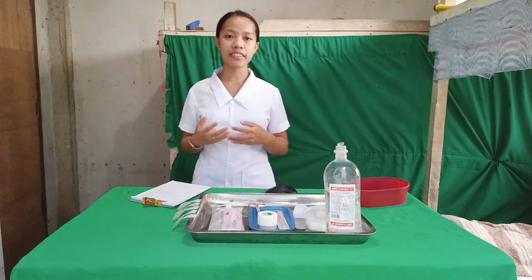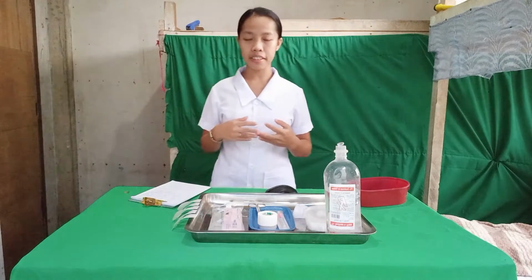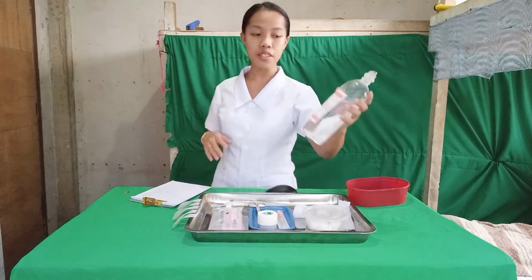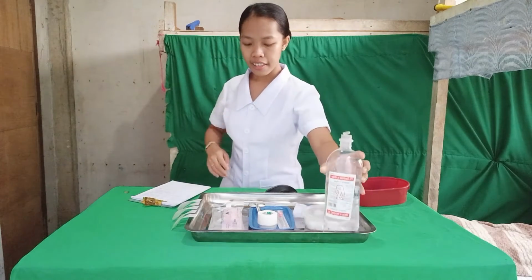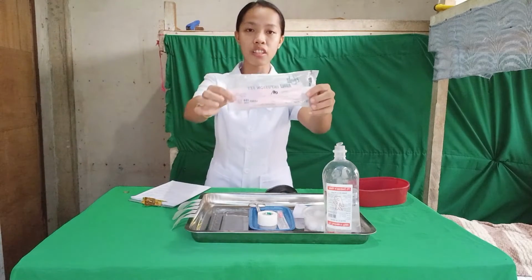Next, we will gather all the equipment and check the labels and the expiration date. Having all the equipment will save time, and checking the label and the expiration date will ensure safety and correctness. The needed equipment in starting intravenous infusion is the IV tray. The IV tray contains the IV fluid, so check the right name, the right dose, and the expiration date. Then the infusion set, so we will check the specification. My infusion set here is a macro set.